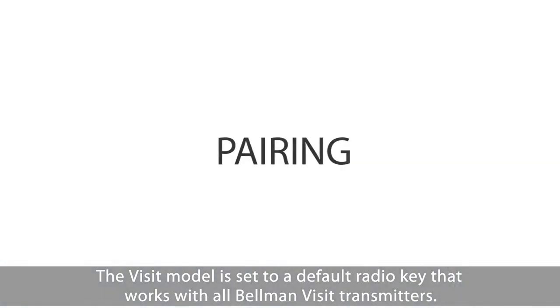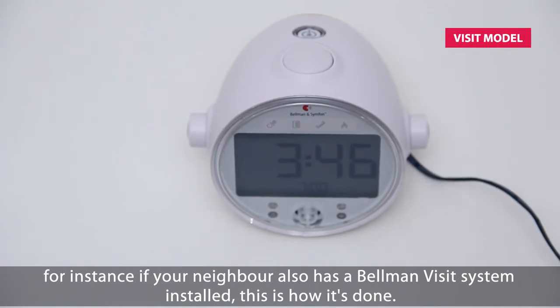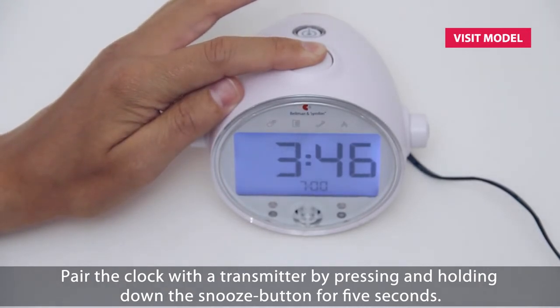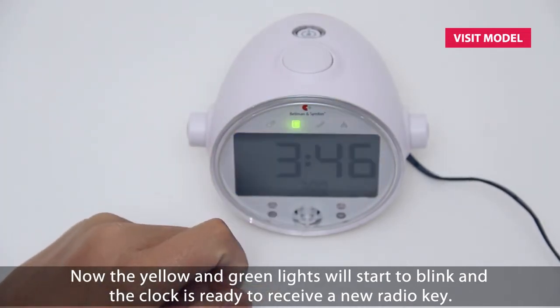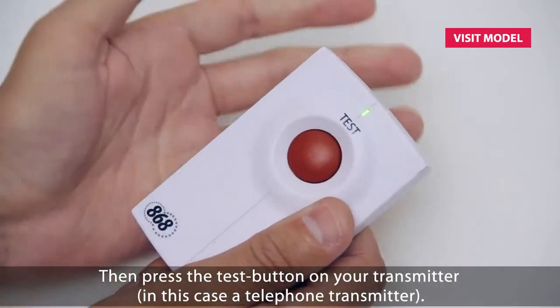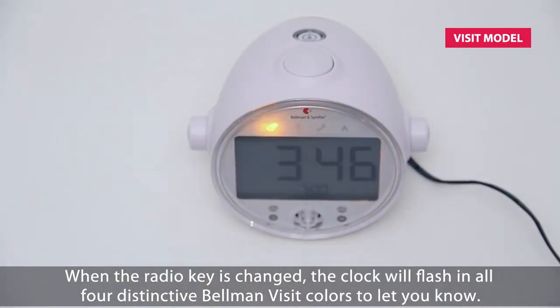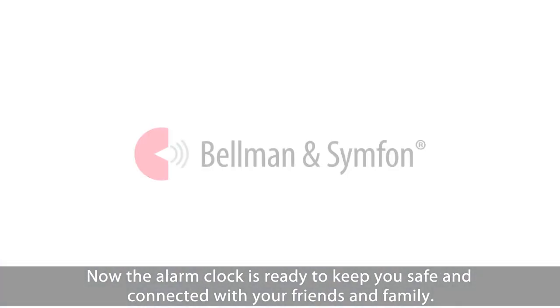The VISIT model is set to a default radio key that works with all Bellman VISIT transmitters. If you need to change the radio key — for instance, if your neighbor also has a Bellman VISIT system installed — this is how it's done. Pair the clock with a transmitter by pressing and holding down the snooze button for five seconds. The yellow and green lights will start to blink and the clock is ready to receive a new radio key. Then press the test button on your transmitter — in this case, a telephone transmitter. When the radio key is changed, the clock will flash in all four distinctive Bellman VISIT colors to let you know. Now the alarm clock is ready to keep you safe and connected with your friends and family.